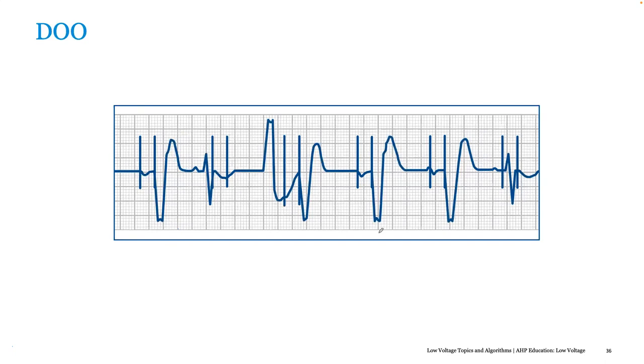Just a question there, AJ. I get given a load of leads and I've never ever seen a lead that does that. Does it have a special name, or is it a very special device you need to use if it can sense only in the atrium and pace in the ventricle? It won't need a special device because the lead looks kind of like the DF1s of the old, where it bifurcates. It has a ventricular plug and an atrial plug, so it's got two plugs on it. Exactly. Okay.